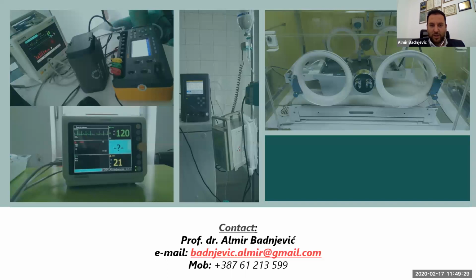Another question: what about diagnostic analyzers and laboratories, does this verification apply? In this case, you cannot say that those analyzers are medical devices with a measuring function. Only devices which have a measuring function can be part of metrology. That's the reason why they are not under that part, because there must be something that you can measure, like energy in a defibrillator, or volume or pressure in a mechanical ventilator, etc.